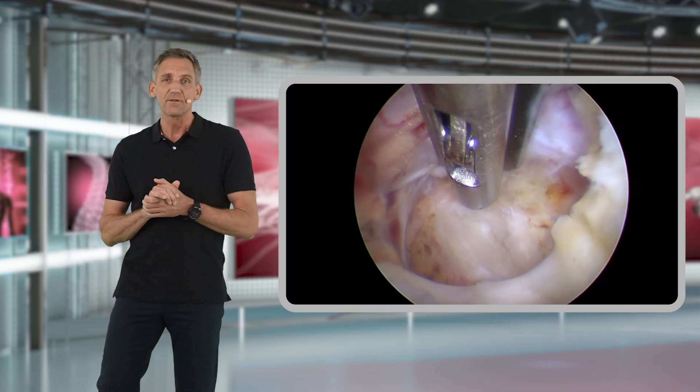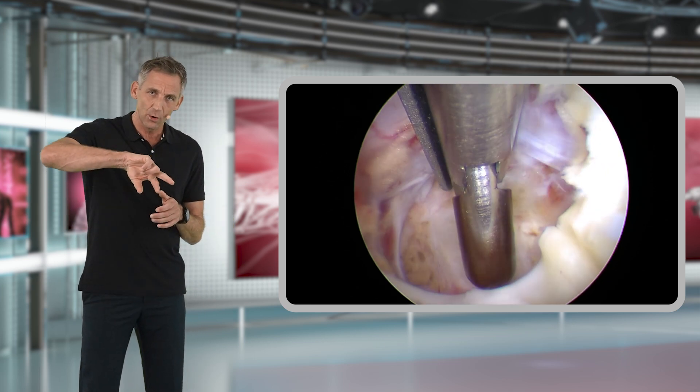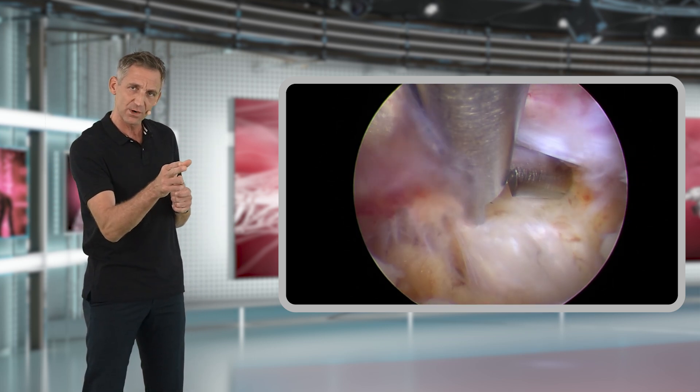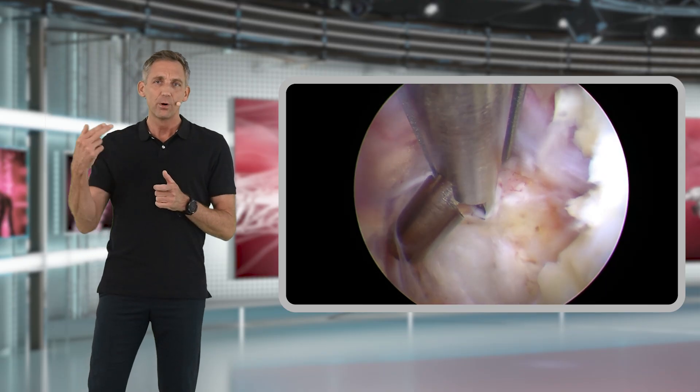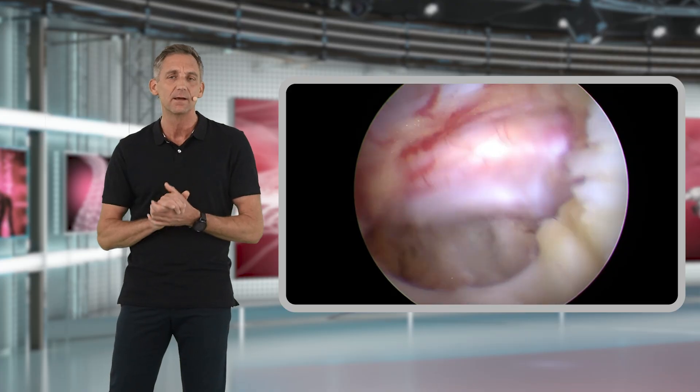You can also open the mouth of your instrument and then carefully go underneath the nerve root or the neural structures, and then pull out any disc fragment that is hiding underneath the dura.